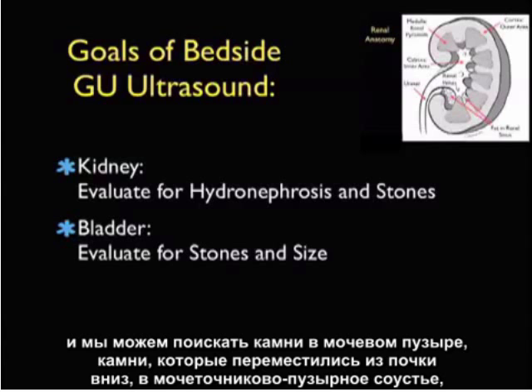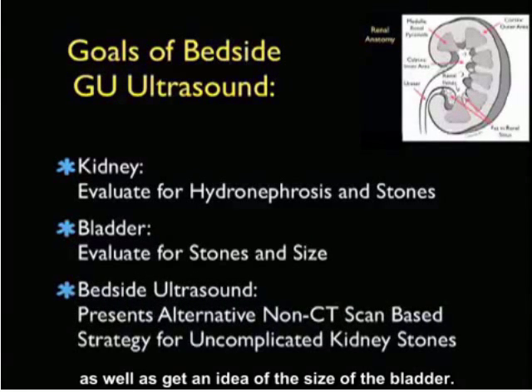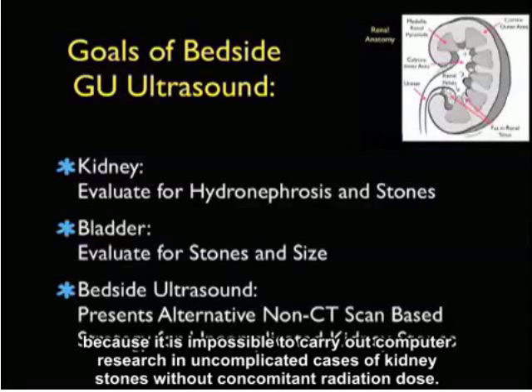We should also include imaging of the bladder with our GU ultrasound, and we can look for bladder stones, stones that have migrated from the kidney down to the UVJ, and also get a sense of bladder size. Hopefully, through this module, we can look at bedside ultrasound as an alternative, non-CAT scan-based strategy for the management of uncomplicated kidney stones without the associated dose of radiation.